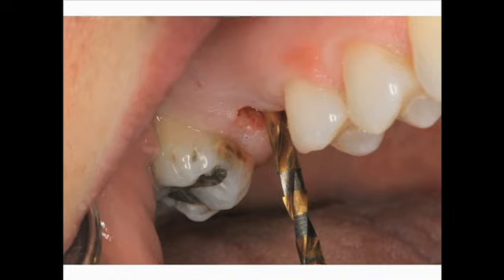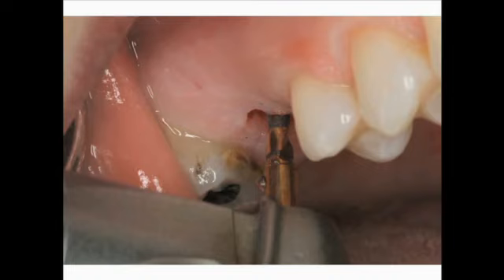We're placing the 2.2 diameter twist drill into the site. It's following the initial osteotomy made by the Lindemann guide drill, and we're measuring to the predetermined depth that we wanted. Now remember, we had almost 3 millimeters of soft tissue. So if you look at this drill, it looks like we are at a depth of 11 millimeters, which is the bottom of the second thick line, but we have 3 millimeters of tissue. So it's going to allow us to put a 9 millimeter implant in position.